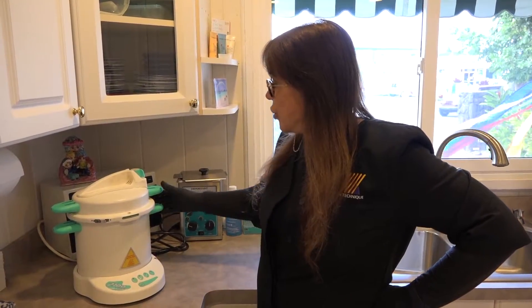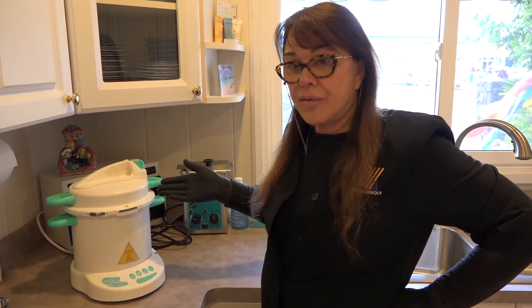For right now let's come back in about 20 minutes when it's done and we'll check it out. Here we are at the done point in our autoclave cycle.